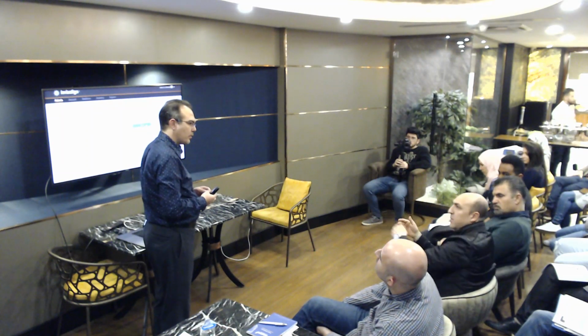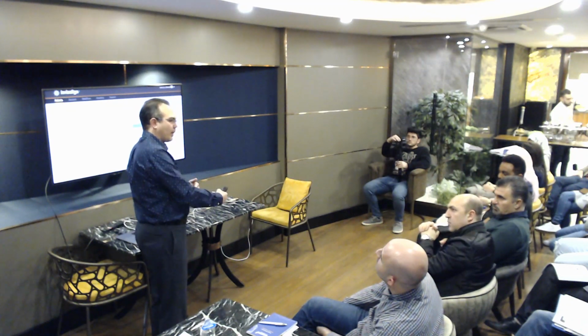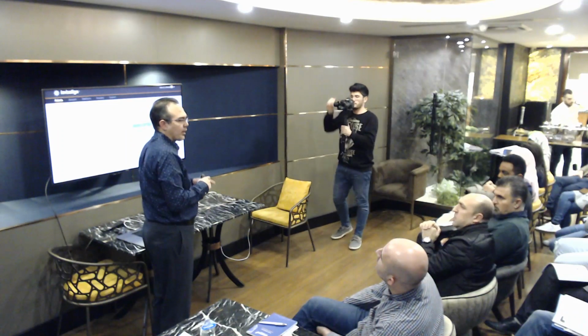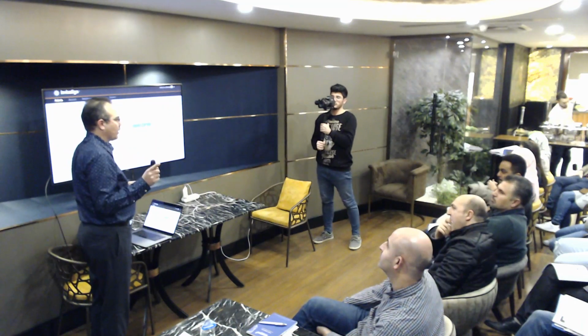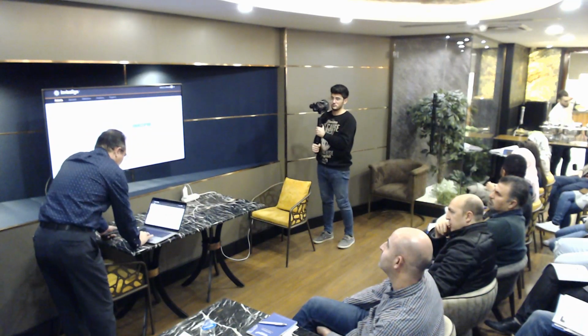Yes. You cannot make this step immediately after the scan, because you cannot start the prescription form without this. It's gonna ask you to connect the scan before anything. So you should wait. Okay. So the group who was working with Juliet is the group who's gonna go first because I think her scan should be ready. Let's check.